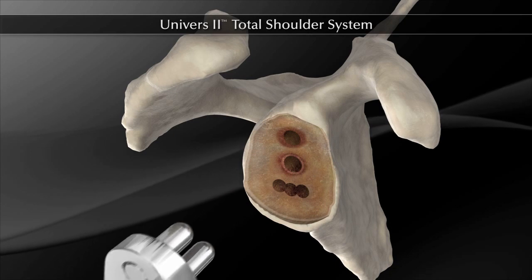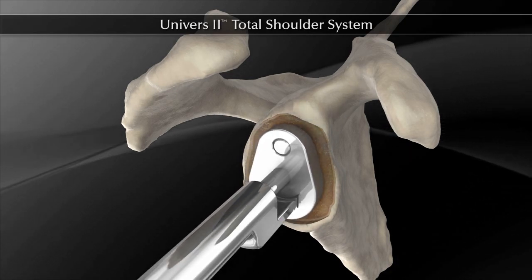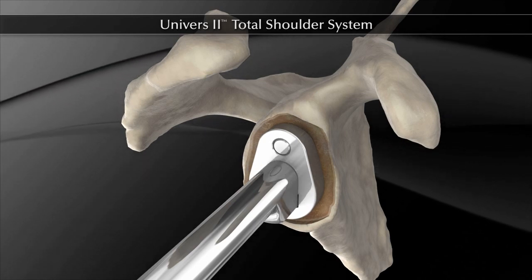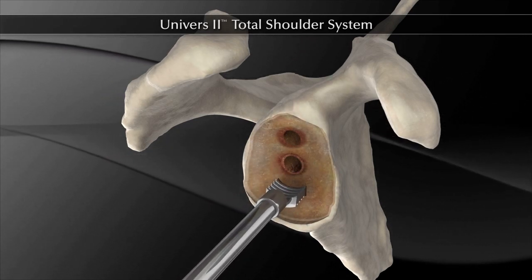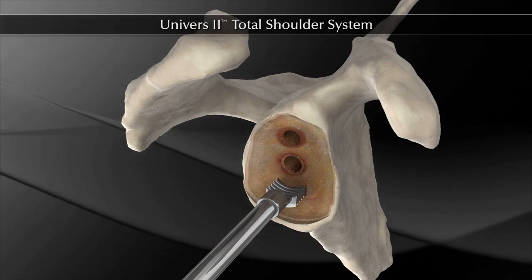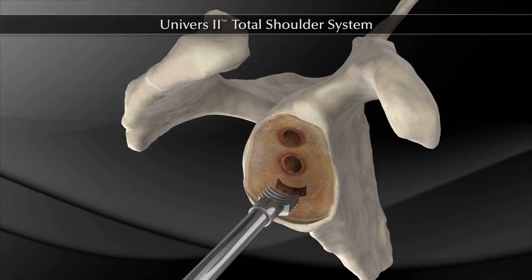Next, the 2 posterior pegs on the glenoid broach are engaged into the previously drilled peg holes in the glenoid. A mallet is used to advance the glenoid broach into the roughly prepared slot. Alternatively, the pegged glenoid punch can be used to prepare the keel slot instead of the broach. This punch is advanced with a mallet until the edges of the punch are flush with the glenoid surface.